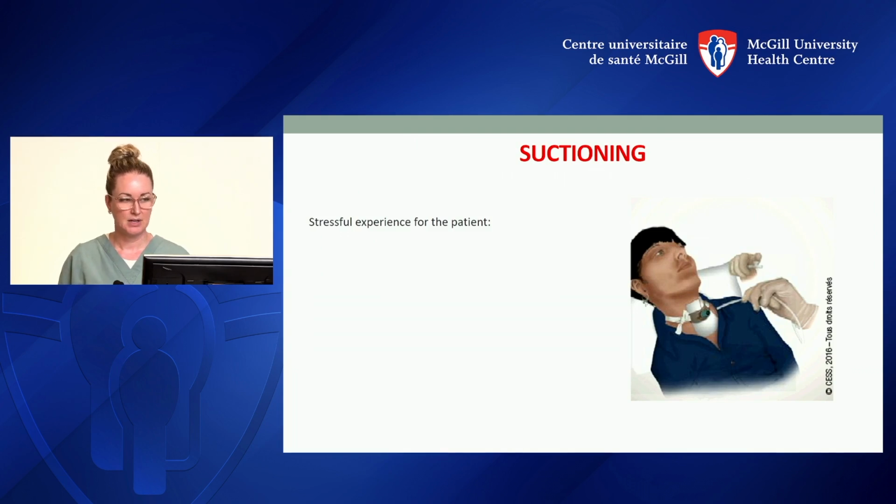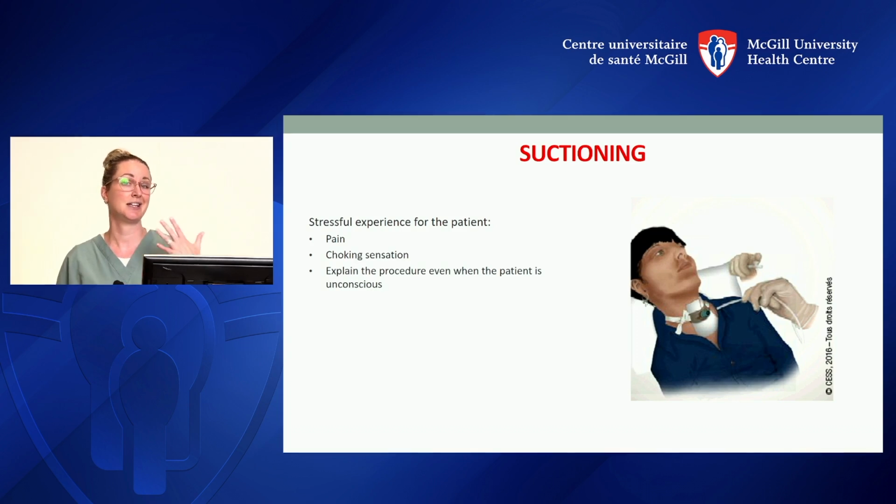Suctioning. Suctioning is a very stressful event and experience for patients. For some people, it can cause pain. It can cause a choking sensation. We're basically taking the air out of their lungs, so it's not a comfortable feeling. It's important for you to explain the procedure even when the patient is unconscious, because they still have their hearing.